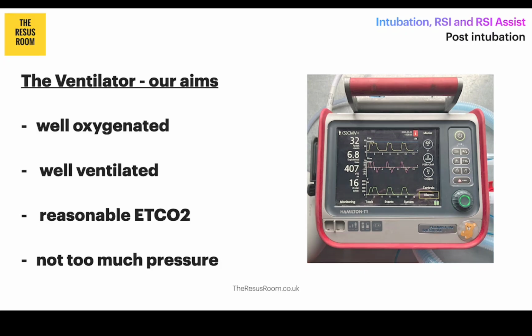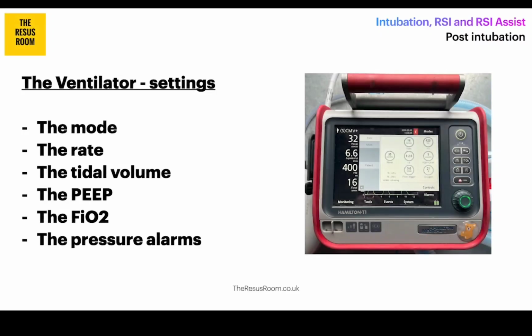So with those goals in mind, let's look at our initial setup of that ventilator. Specifically, the mode, the rate, the tidal volume, the PEEP, the FiO2, and the pressure alarms. Right. What ventilator mode do we want to use then?